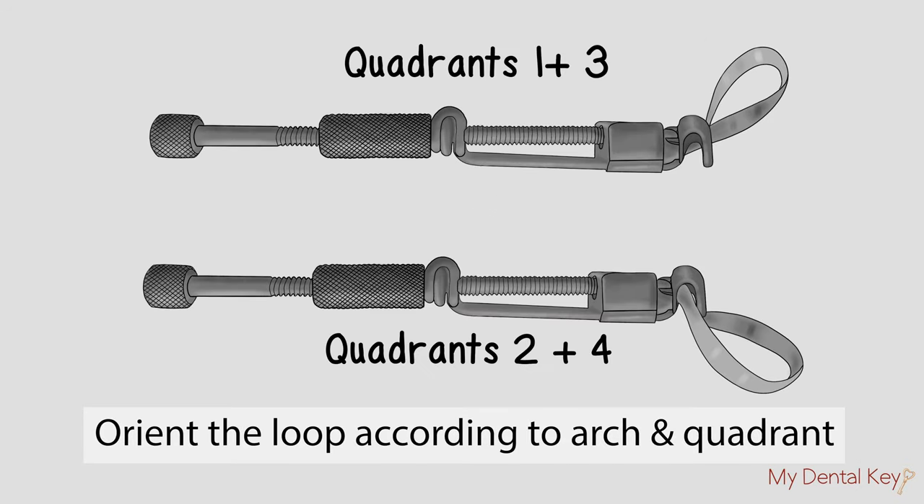Again, left and right are in relation to the diagonal slots on the vise. Remember to flip over the Toffelmeyer so that the U-shaped slot is facing toward the gingiva.